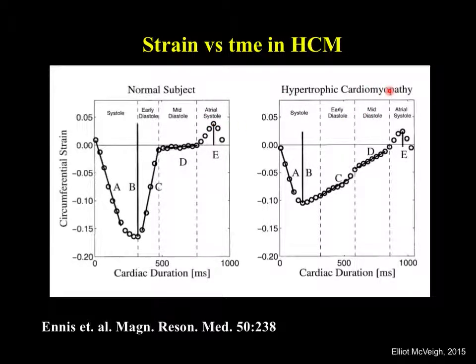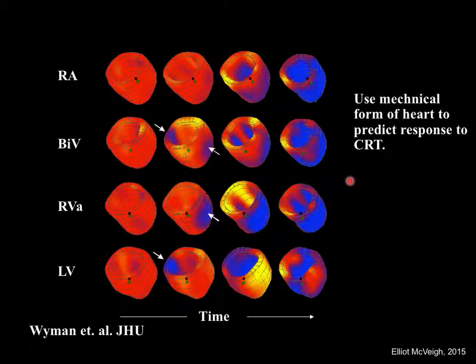In someone who's headed down the pathway of hypertrophic cardiomyopathy, their muscle is abnormal. They contract, but it's stunted. And then when that heart relaxes, it takes a very long time. It's very viscous, like the heart just sort of opens up quite slowly. And that is a telltale sign of heart failure, is this slope changes. So in this region C, between the valve, basically the mitral valve opening and coming up here, that slope is the distinctive feature that shows heart failure.